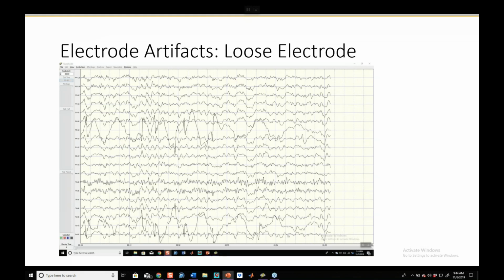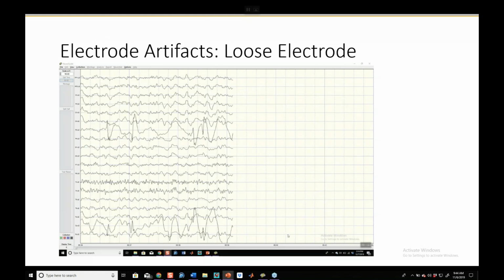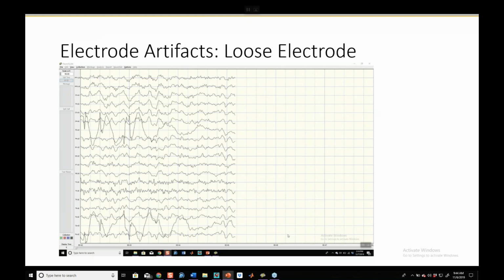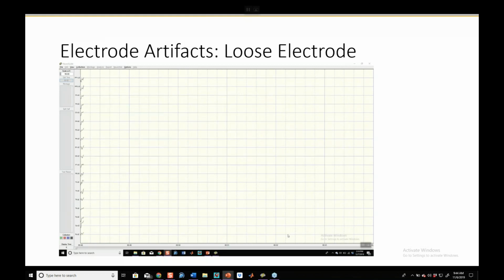are they sharing field and phase? Are they doing the same thing? It almost appears that way in the beginning, but no, actually they're not. One could not fit into the other, right? They are not doing the same dance, although it's variations on the theme, but we certainly have artifact because we have two electrodes in this case dancing to the beat of their own respective drums.